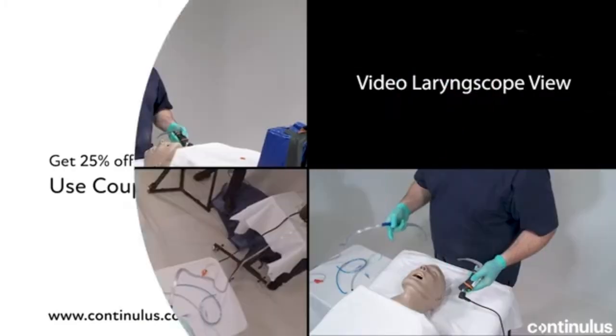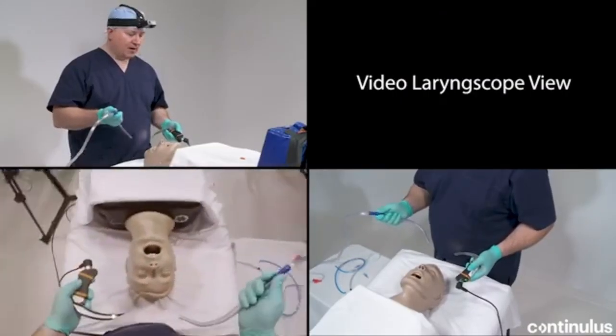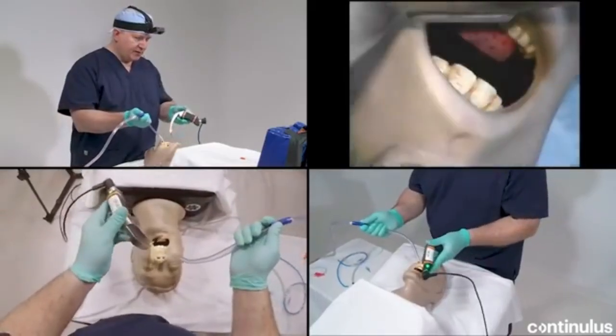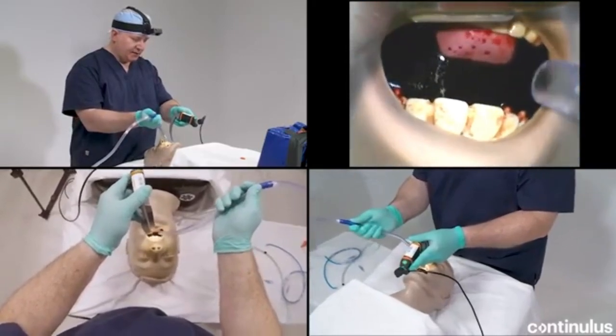As we know, in emergency airway management, time is critical. I'm going to show you some techniques to save you a substantial amount of time. I'll begin now by focusing on the oropharynx. As we see, both with the laryngoscope as well as our exterior cameras, I have an entirely full mouth of airway contaminant made out of artificial blood.